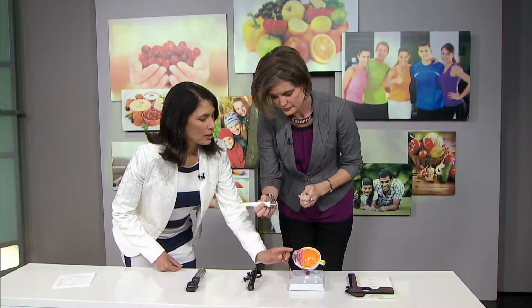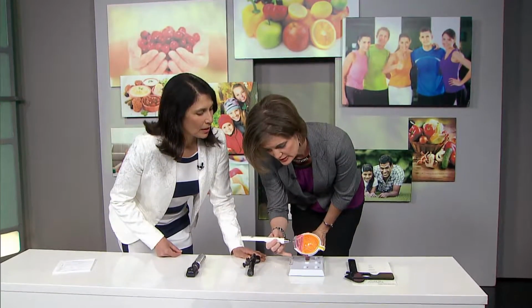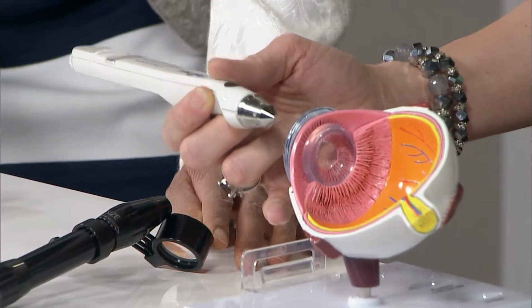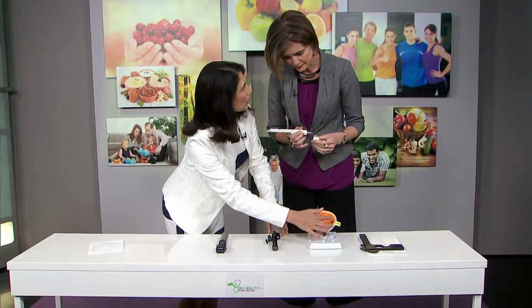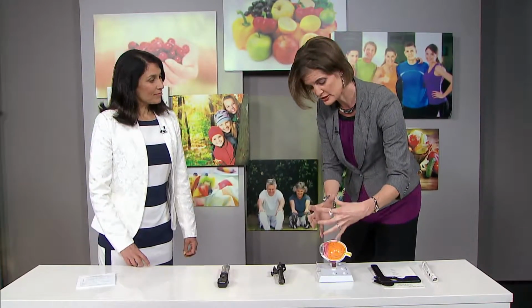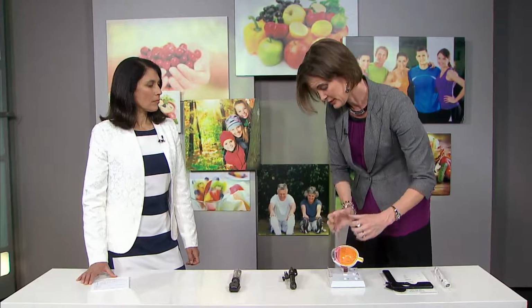So you numb the eye and then you just put it gently against? Just barely touches the surface of the cornea. And then it'll beep a couple of times and give you a reading, and then you can move to the next eye. And that tells you the pressure inside here? That's right. So the eye pressure is the inflation pressure of the eyeball, so that it measures how much pressure it takes to keep your eyeball inflated, so it's a ball and not a raisin. And that way people can understand that it's not blood pressure that I'm talking about, but literally just how much pressure it takes to keep the eyeball inflated. And if that pressure is too high, it can put pressure on the nerve tissue and cause it to die off over time, which is what glaucoma is.